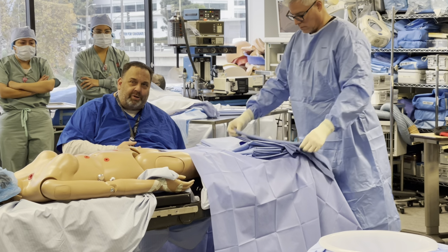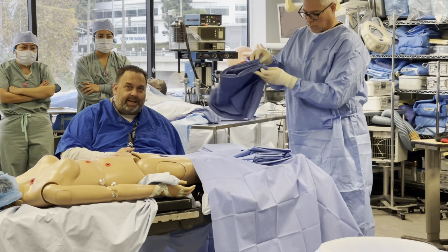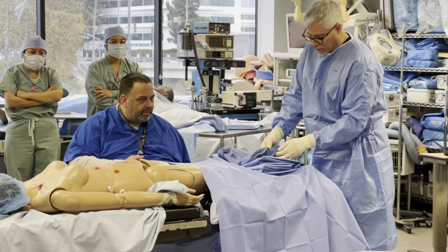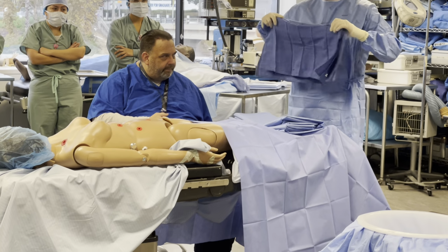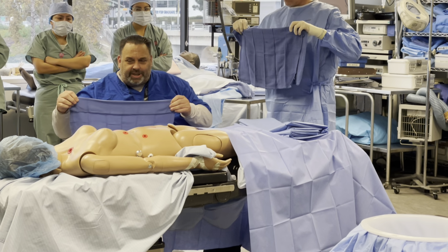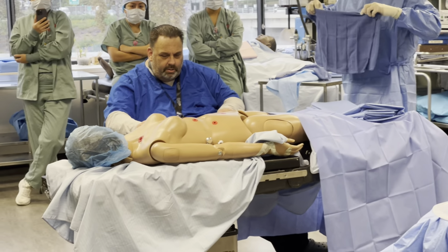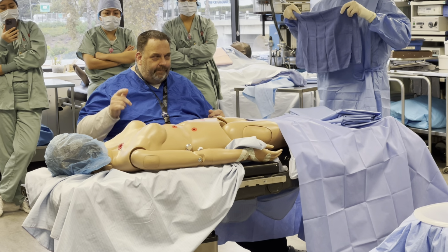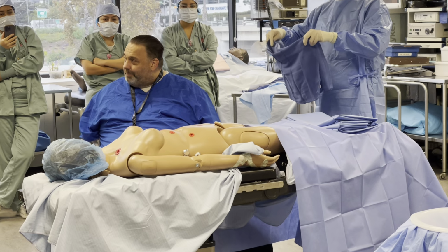Next question on the test as you move forward. Where do you stand when you're draping with a patient, doctor? On the same side. Okay. So that would put you right here. Now, when we square off, my first towel goes where? Why is it going in front of me? For sterility. To create a sterile field, because we're a barrier, right?